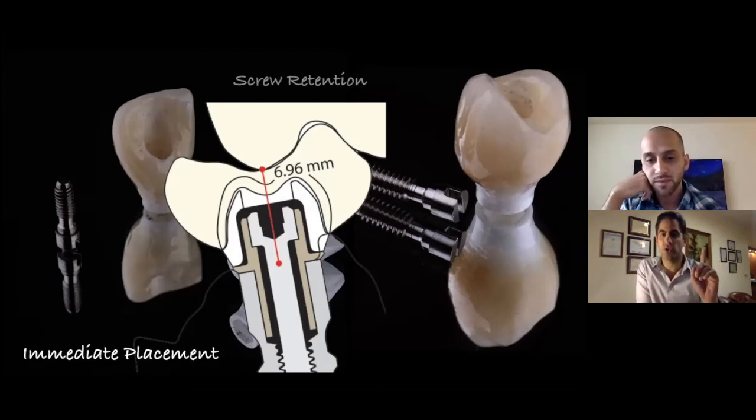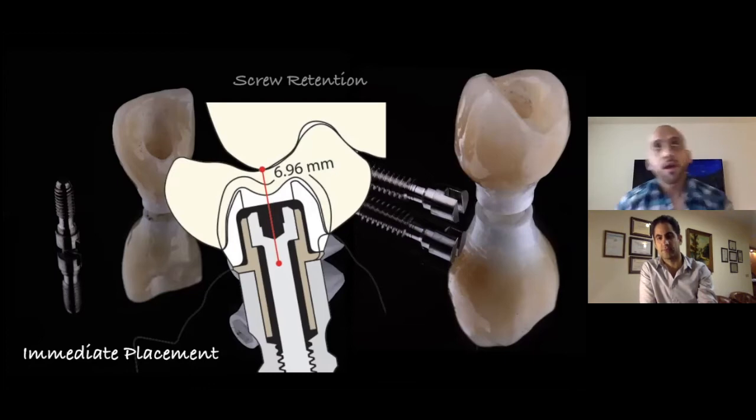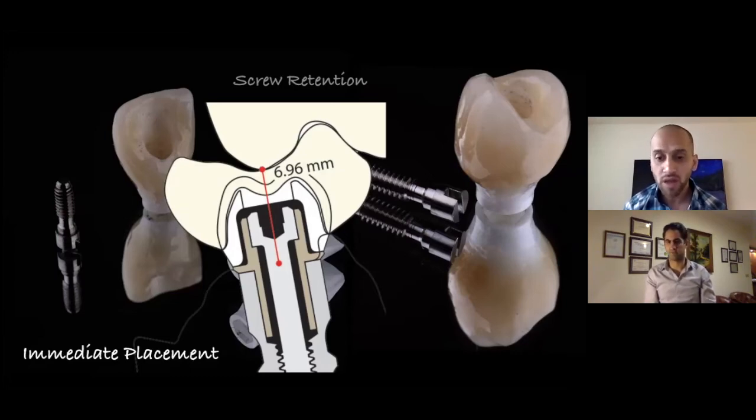Okay. And one final question for this part. For dentists that want to have cement retained crowns on implants, do you recommend them to go with the temporary cement or permanent cement? That's a very good question, many people will answer this question differently. I don't have a whole lot of experience with cement retained restorations because I don't do a lot of them, but I do know that there are many different techniques out there. Some people recommend using a temporary cement. You can do that, but then you run the risk of it becoming loose.